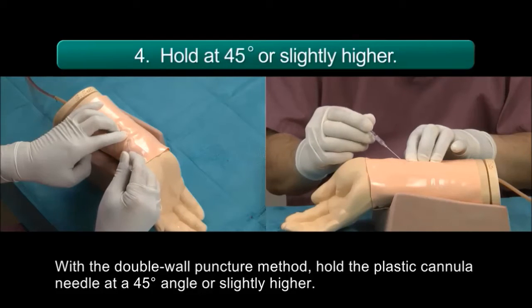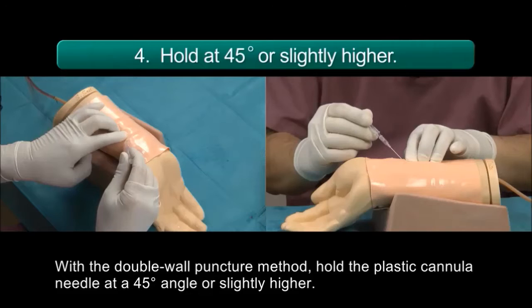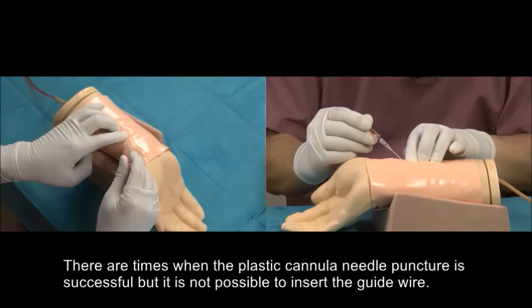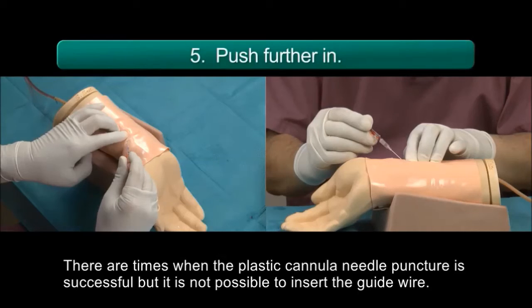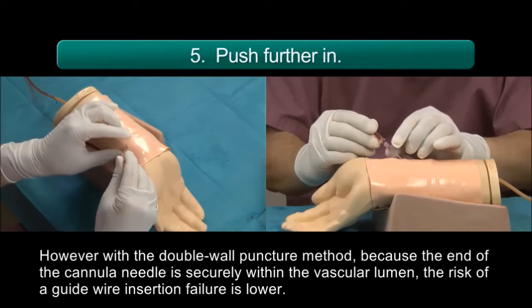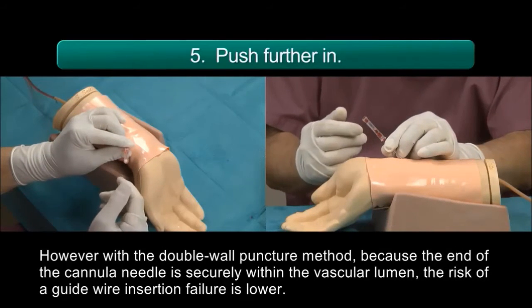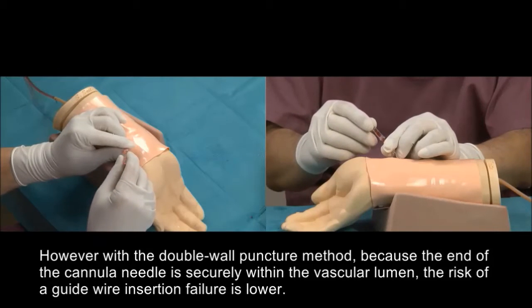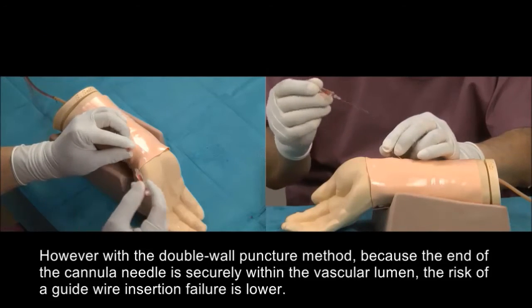With the double wall puncture method, hold the plastic cannula needle at a 45 degree angle or slightly higher. There are times when the plastic cannula needle puncture is successful but it is not possible to insert the guide wire. However, with the double wall puncture method, because the end of the cannula needle is securely within the vascular lumen, the risk of a guide wire insertion failure is lower.